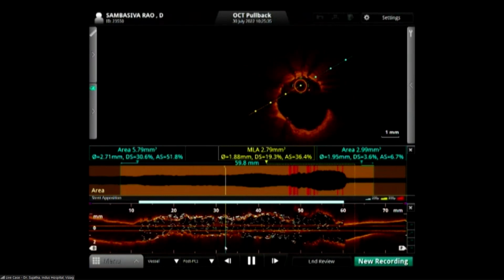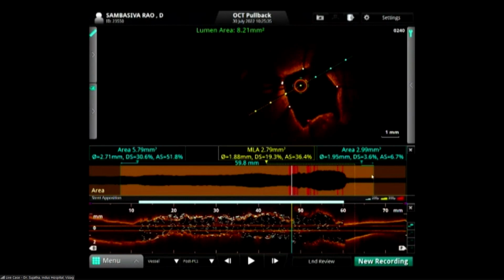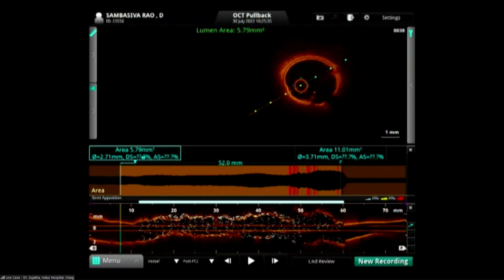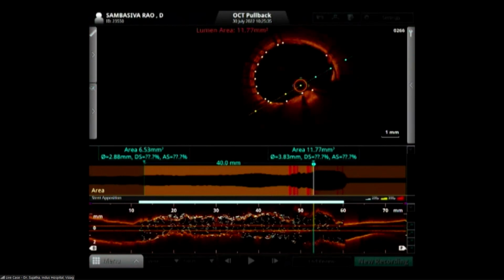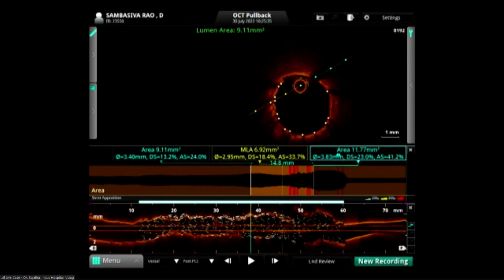I think we did good preparation. Dr. Ramesh and Srinivas Kumar, Dr. Sandeep, what do you say? Yeah, perfect. This looks very good. Excellent. There is always that area where we were talking earlier, but I think it's still okay. Can you tell the MSA there? 11.1, no? Yeah. 11.7.